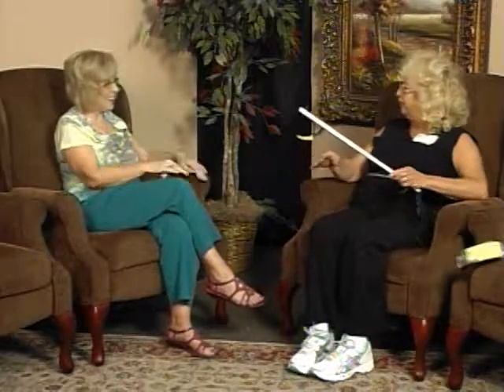Thank you so much. So I picked up about a pint of water. Again, they're not rated for heavy things, and if I couldn't pick it up, I could drag it to me. They're not an extremely expensive tool. I think you're going to look at $15 to $21, depending on where you buy this, and well worth it. You can actually pick up small coins. I have seen people that are so awesome with this, out of necessity. And very wise, one more way to prevent falls in the home, prevent falls wherever you are.